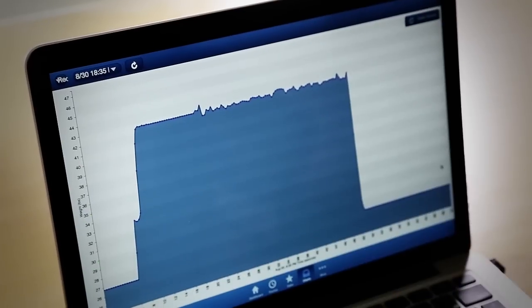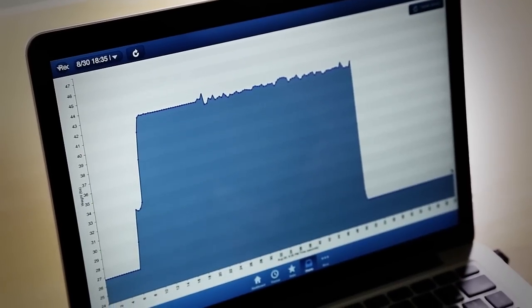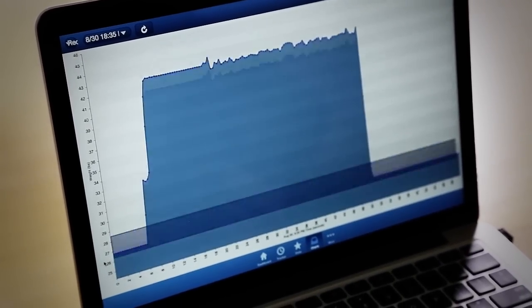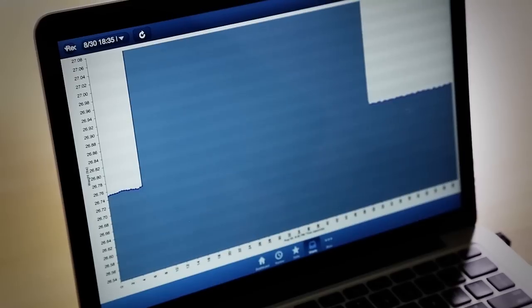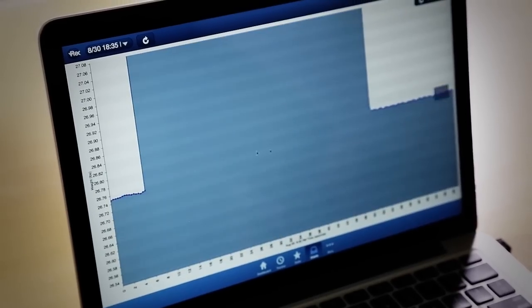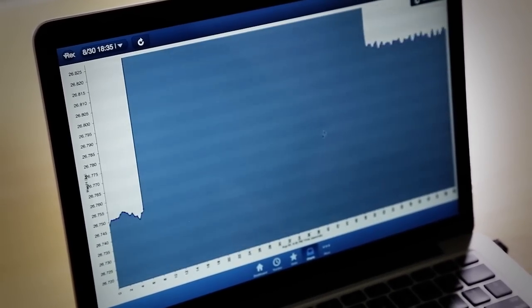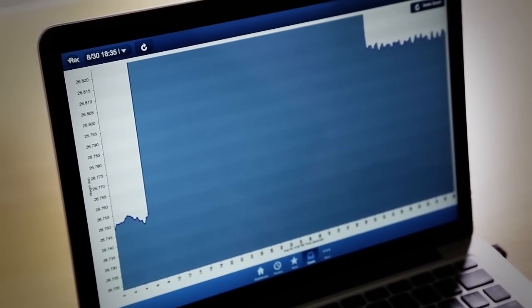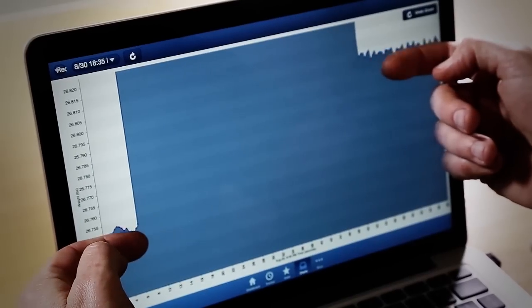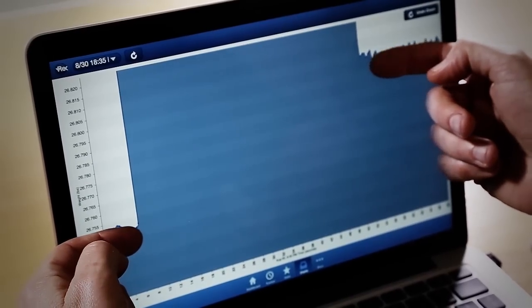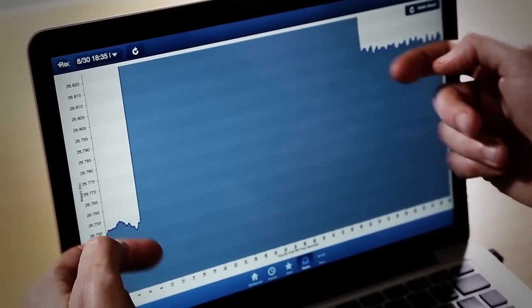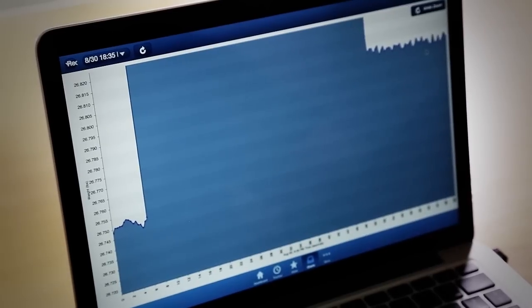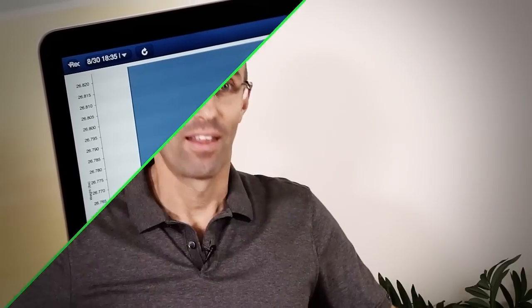Now let's take a look at how much waste the cat left in the box. We zoom in very carefully here. We can see that there's a slight difference between the levels here, approximately six hundredths of a pound. This illustrates how accurate Telio is.